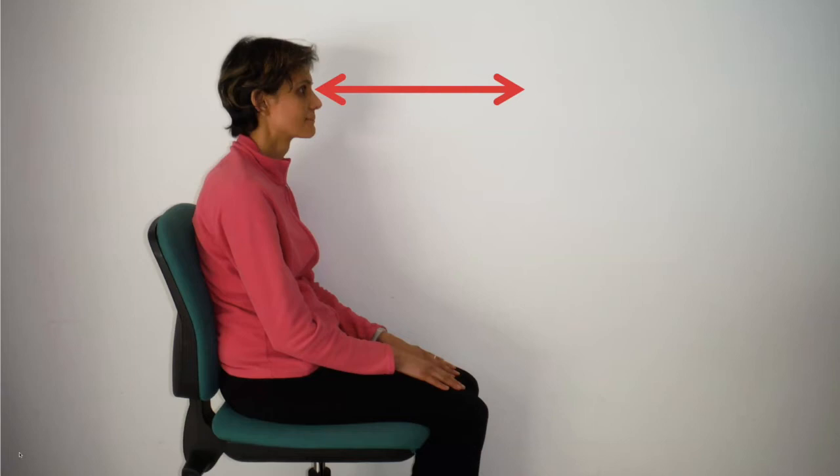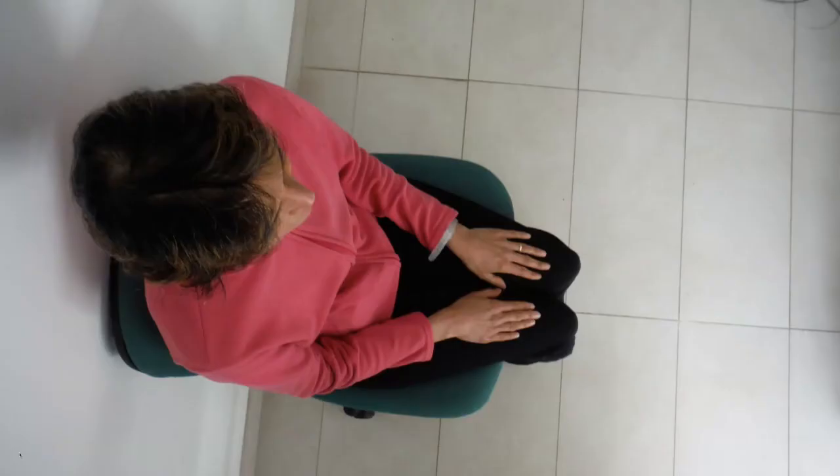You need to triangulate not only your horizontal position, but also your lateral position relative to the patient. Here you need to make sure that you are coming in at an angle of between 20 and 40 degrees to the side of your patient, so as to come straight down onto the patient's optic nerve.